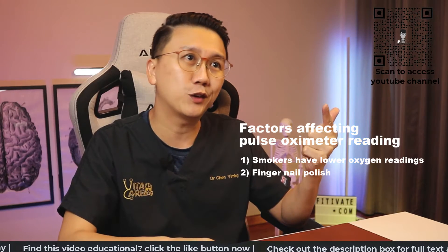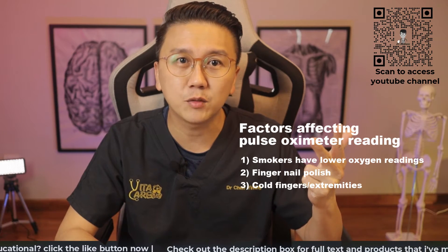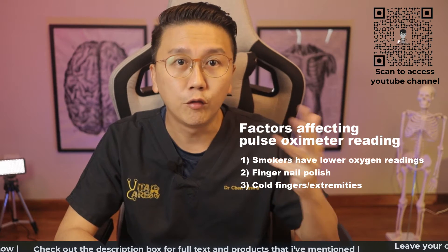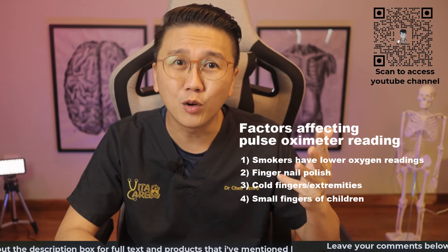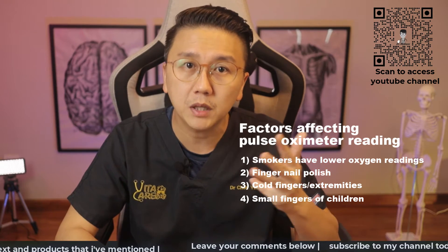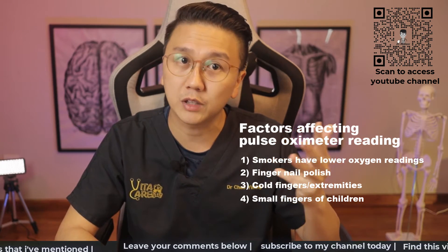Ladies, please take note. Three, when you are cold, the circulation on our fingertips may be reduced and that can affect the accuracy of the pulse oximeter reading. Four, when the finger of the patient is too small, such as in a very young child, the issued adult pulse oximeter may not be able to read the oxygen and pulse, or may give a wrong reading.